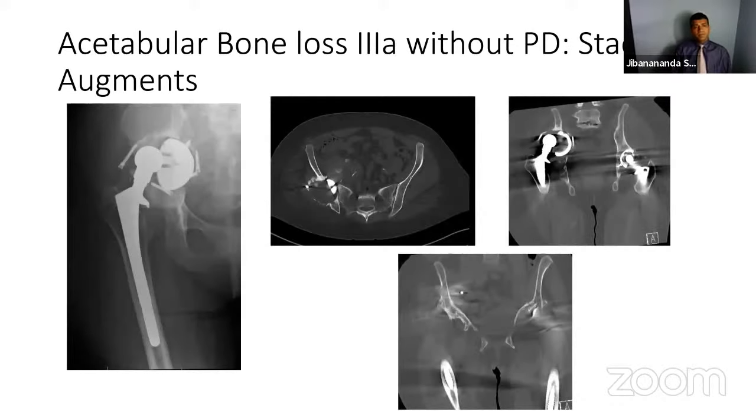This is another patient that was referred to my partner, and I helped with the surgery in this one. There was significant bone loss. The key part for this one, if you look at the CT scan, is that there is absolutely no bone to anchor to. This is the most lateral and superior bone loss. You barely have a posterior superior iliac spine. This makes it very challenging.